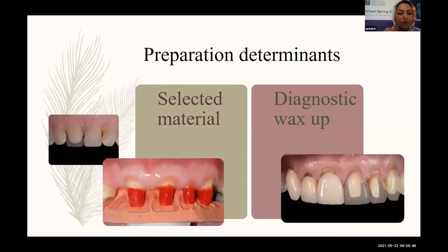As you can see, two factors play a key role in preparation design. Each specific material needs a certain thickness to be resistant against forces. On the other hand, the diagnostic wax-up, which is of course verified in the patient's mouth, tells us about the available space.